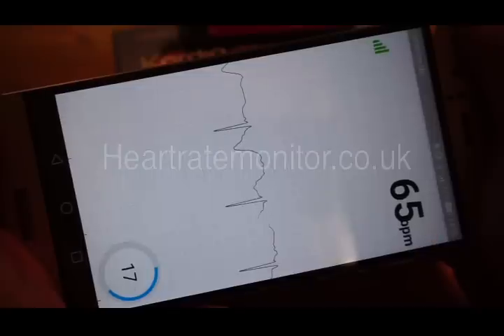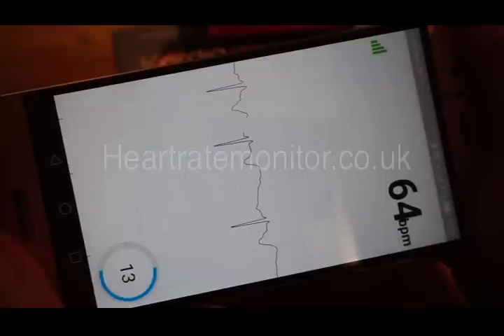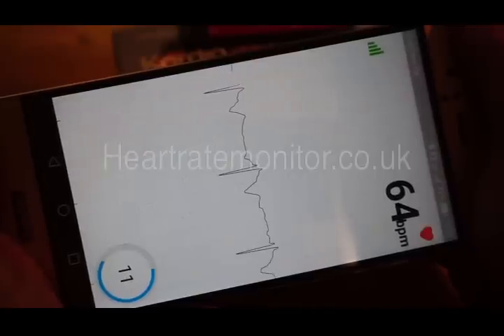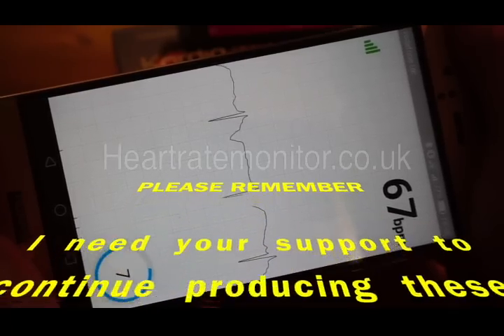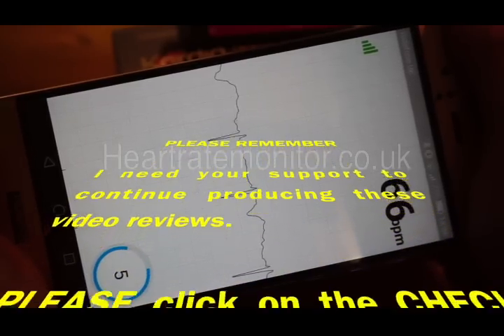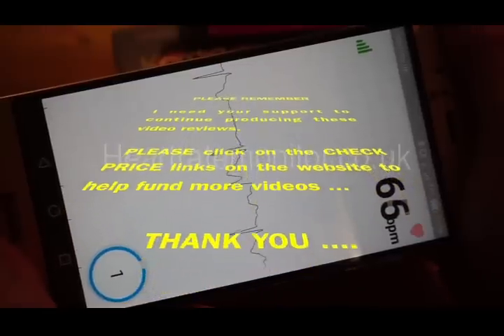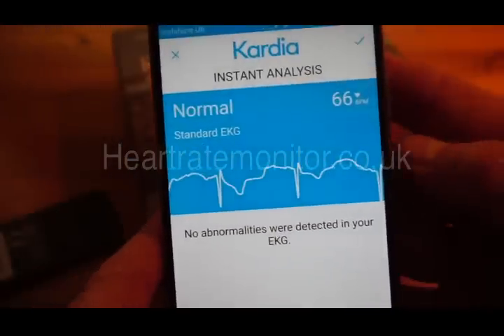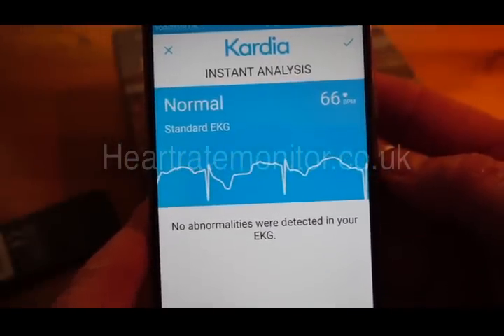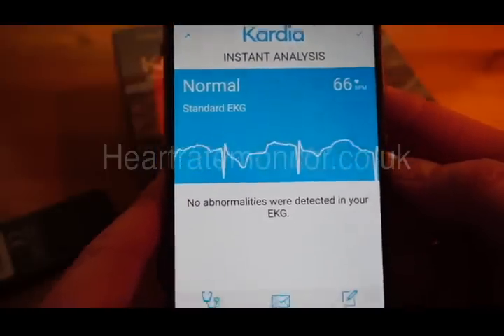It requires a good clean reading for 30 seconds. What it's looking for are signs of atrial fibrillation, or AF — that's what this device is all about. ECG is all about looking for atrial fibrillation. And there is my recording — pleased to see it shows a normal reading.